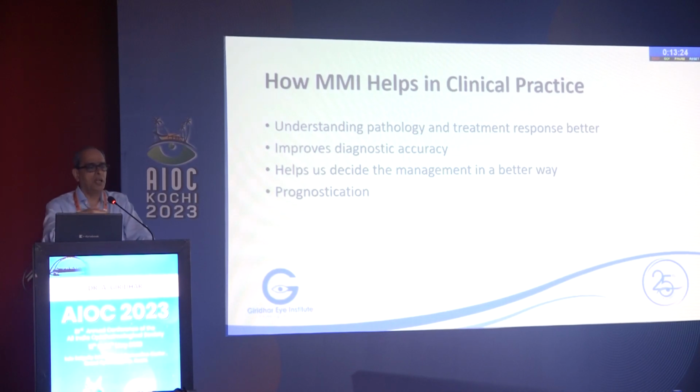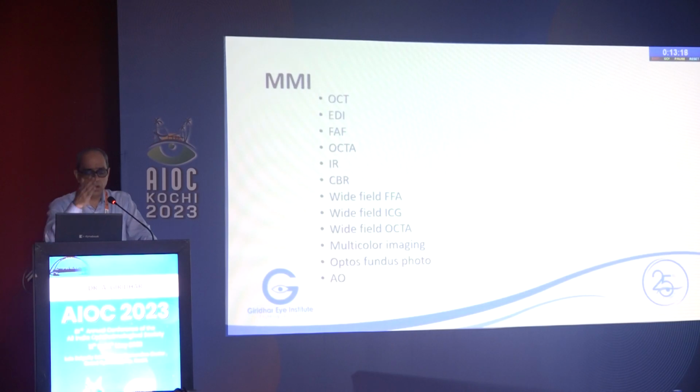So if you use OCT and autofluorescence, it becomes multimodal imaging. You understand? So with this, you got a whole array of diagnostic tools. You can see here OCT, which Dr. Rajendran spoke about, autofluorescence, Octa, which Dr.